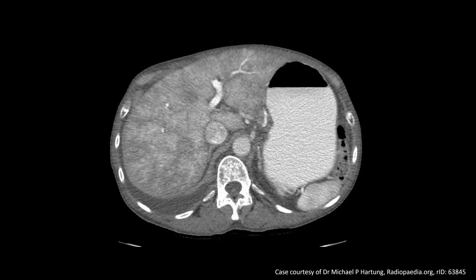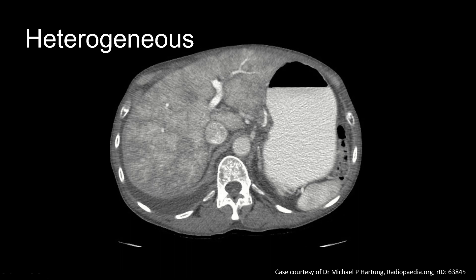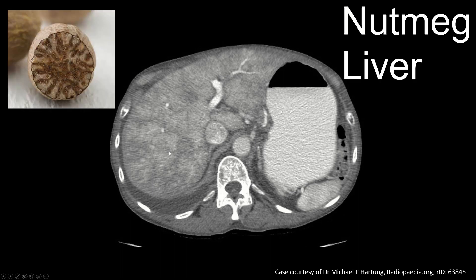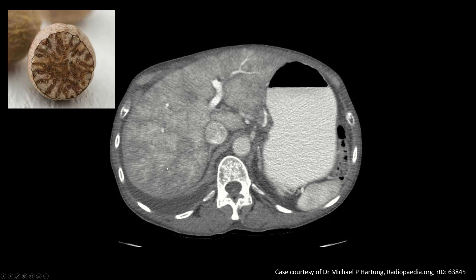Moving along to this last set of pathologies, this is a CT abdomen with IV contrast in portal venous phase. Remember we said that normal liver parenchyma tends to be pretty homogeneous. In this liver, the background liver is very heterogeneous and mottled. The pattern we see here has been referred to as a nutmeg liver appearance. This occurs as a result of venous congestion, and the areas that look dark are areas with reduced portal flow.